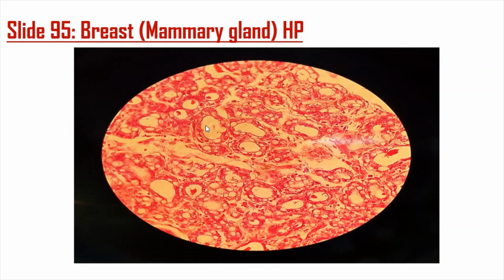So this is what you are drawing. You're drawing this and you're showing these intralobular ducts. So these are in cross section. These are intralobular ducts. Draw about 4. 1, 2, 3, and 4. And then these red dots here that you're seeing, these are blood vessels. And if you can see this colloid material inside of the intralobular ducts, this is mucus that is produced.